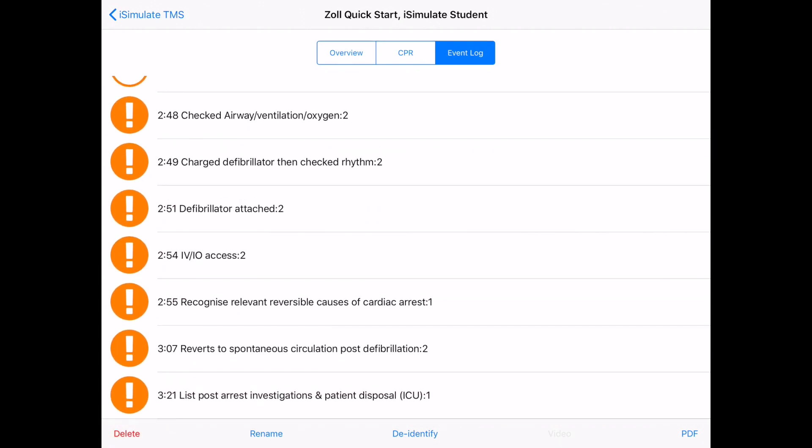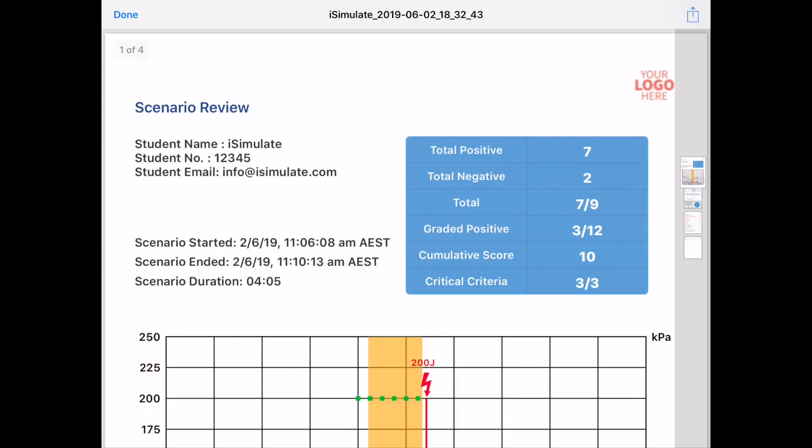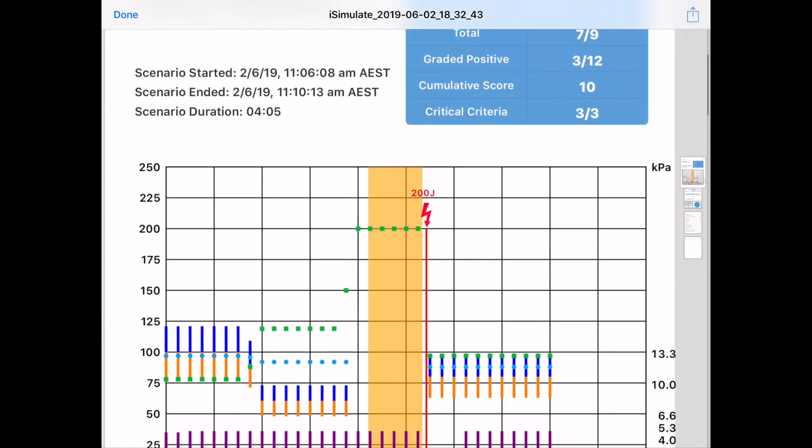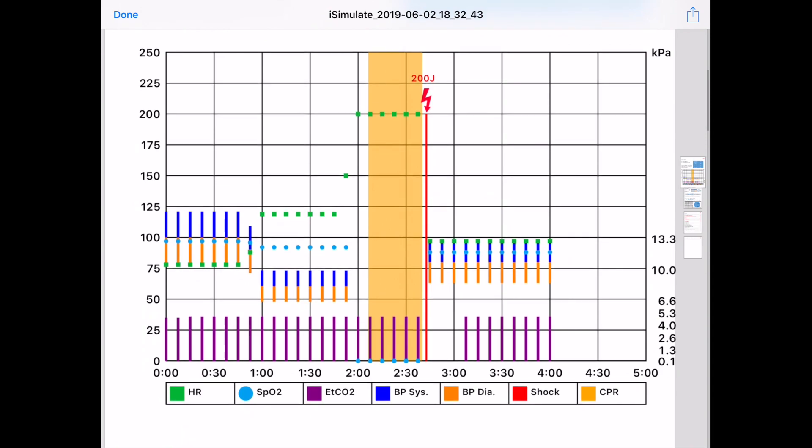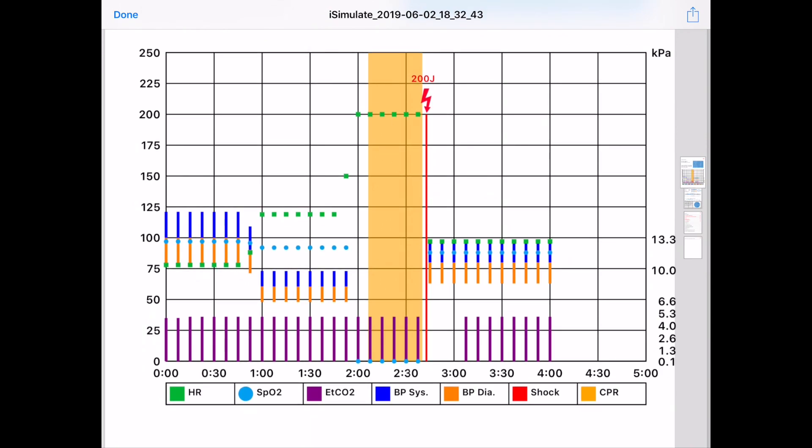Now if I press on PDF, it now shows me a review of the scenario, not only with the checklist items, but also a graphical representation of the vital signs and the major events.